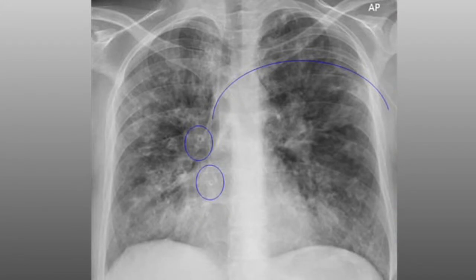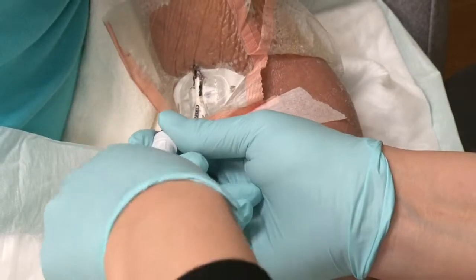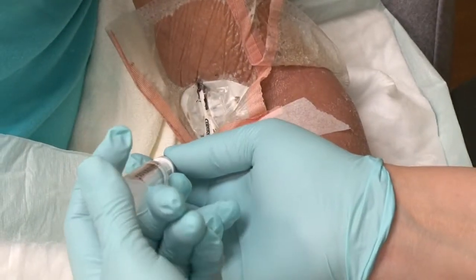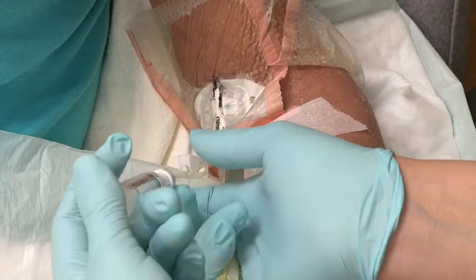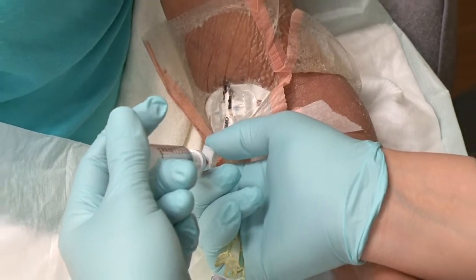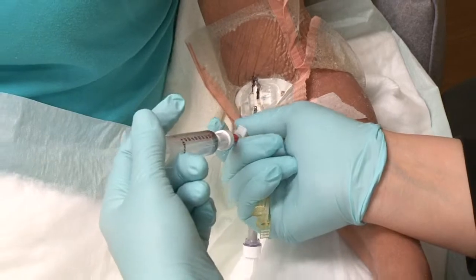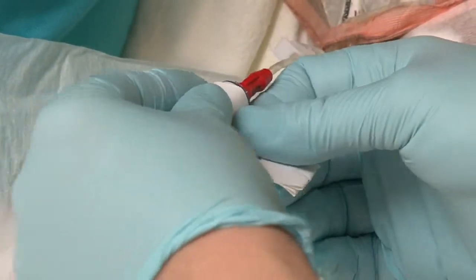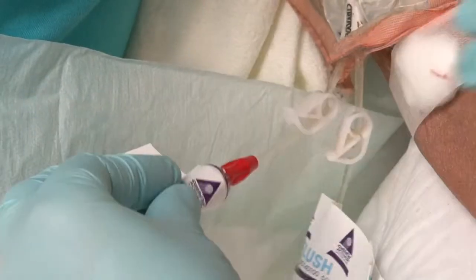This may involve you receiving an X-ray to confirm that the tip of your catheter is located where it should be in the large vessel leading to your heart, or you may receive special medication directly into the catheter to help dissolve a clot in your line. This type of medication may be given twice if the first dose does not open the line. Sometimes a central line can become blocked to the point that it needs to be replaced. Your care providers will do all they can to help prevent this.